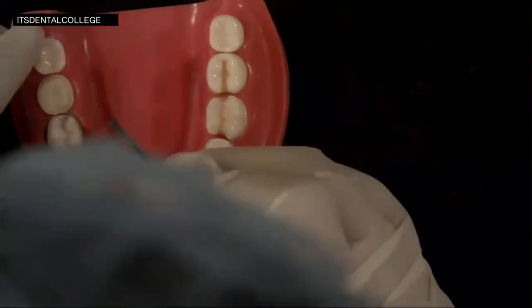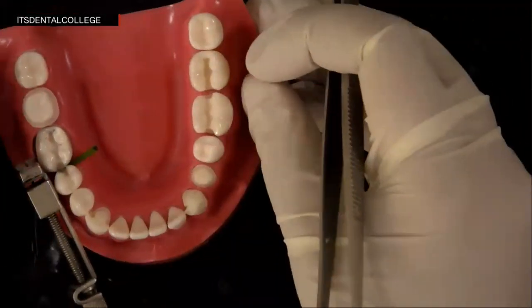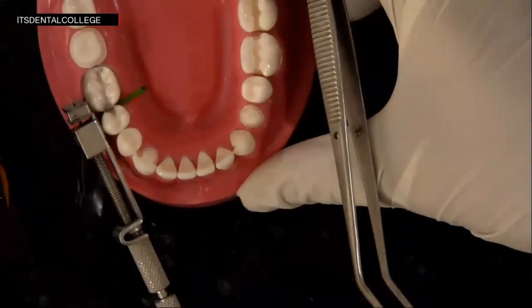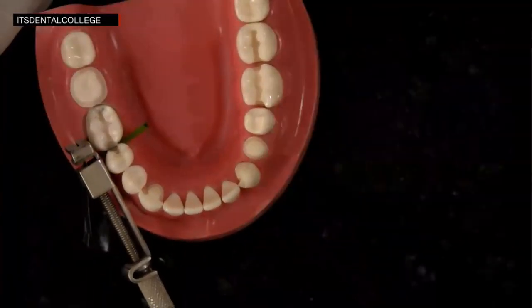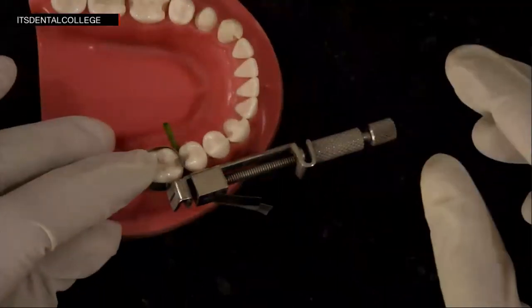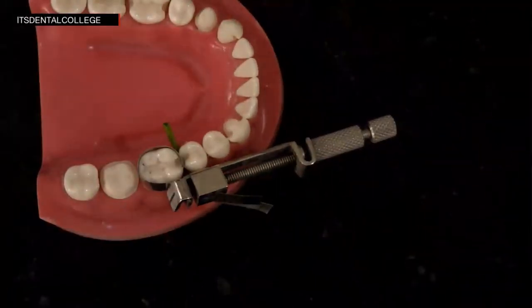So now you can see that there is no gap between the gingival margin and the tooth. So this is how the matrix band, the Tofflemire band, has to be placed, right?